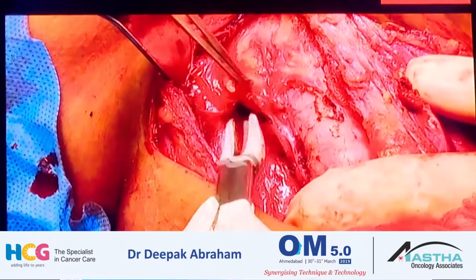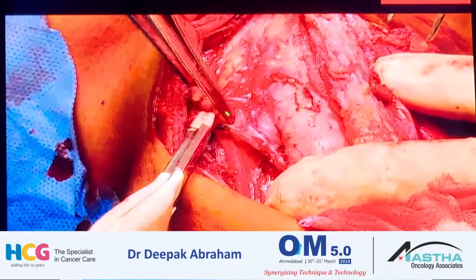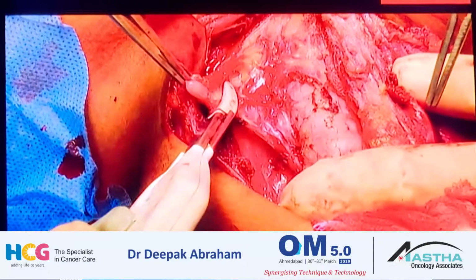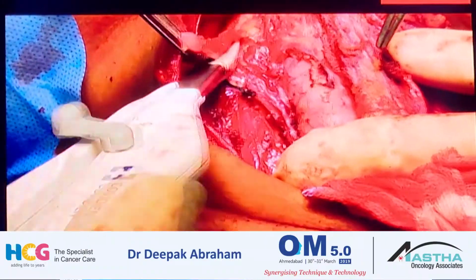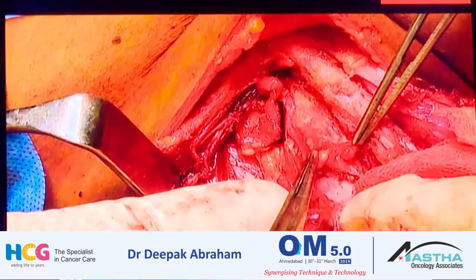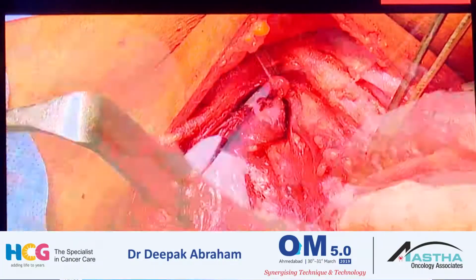Yeah, so that's the central neck dissection, and you can see the whole thing is about the nerve. You dissect out the nerve right down, keep the lymph nodes up. You can seal it, you could use bipolar, you could use some vessel sealing device or even ties to take out the central neck. And mind you, there would be nodes even below the recurrent laryngeal nerve in the paratracheal groove, and you need to be aware of it and take that out too.